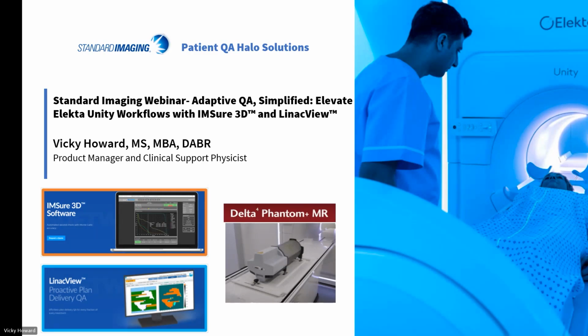So if you do have some very small fields, you will see more variance. But according to that article, and when you read it, you can probably dive in deeper and get more information than I'm giving you, SIMOCA actually is closer to what they consider reality. Now, whether that's their measurement or not, because of course we don't know 100% what it should be, because there are variations that go into your measurement versus your Monte Carlo model as well.